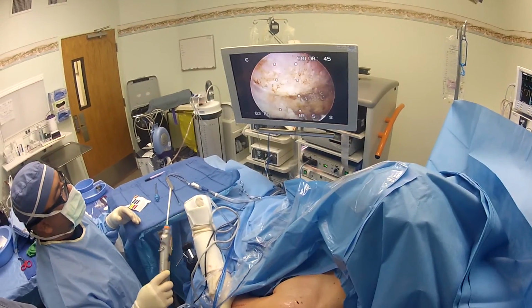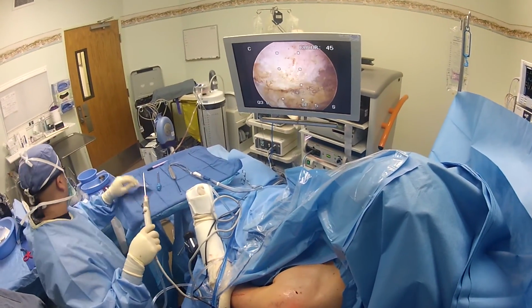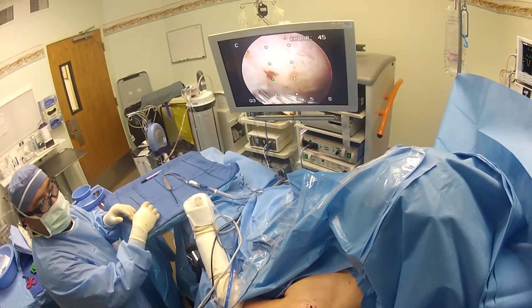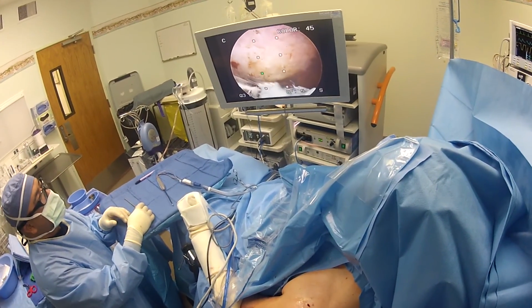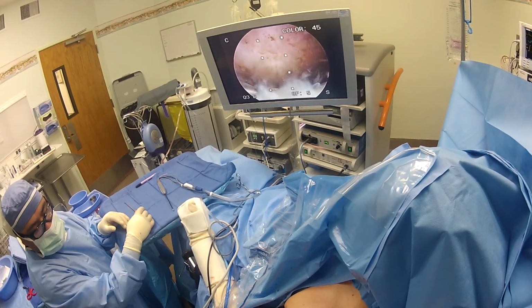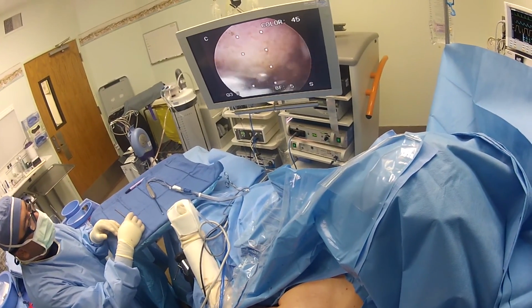So as you can see here, he has a pretty good hook, so we are going to do an acromioplasty. Burr, please. Try to keep my incisions small there so I don't have water leaking out quite as bad. I wouldn't want to give you the impression that there's no water leaking.